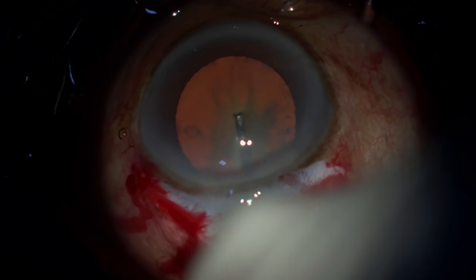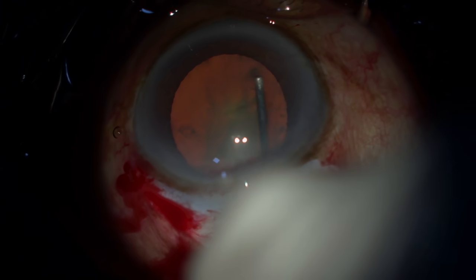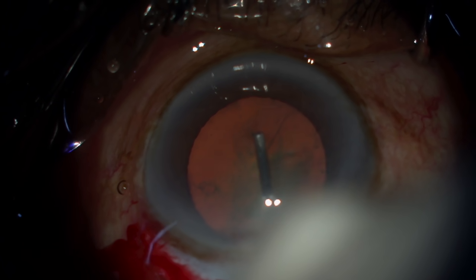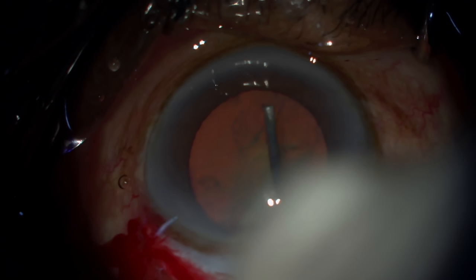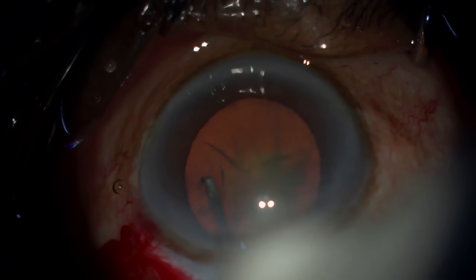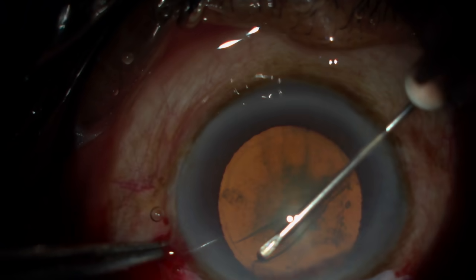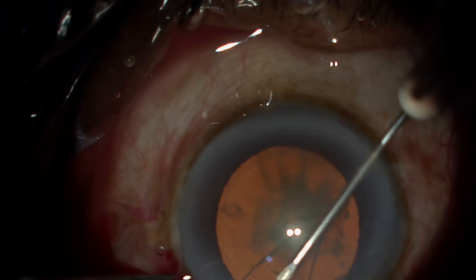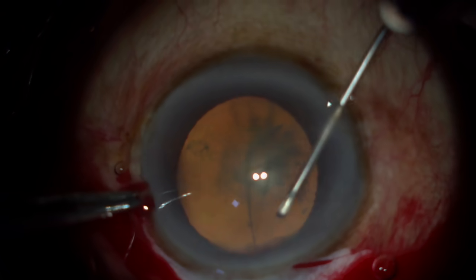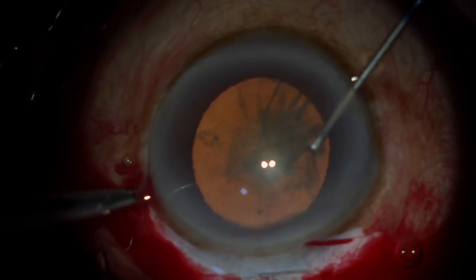Continuous curvilinear capsulorhexis is one of the most important steps. While lifting the flap, don't go to the extreme end, because once you lift the flap, if it goes under the iris it might disappear and will be difficult for visualization. There are two forces — the shearing force and the ripping force — both should be used simultaneously to make sure that the capsule is round, it is big, and you are having it under your control. In a well-dilated pupil, you can use the pupil margin as a marker so that it does neither become too big nor too small.